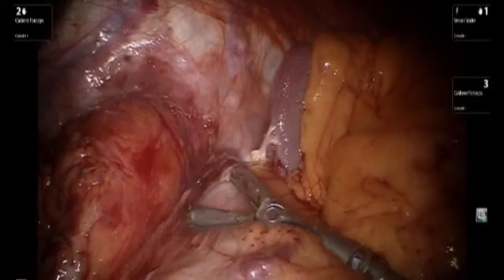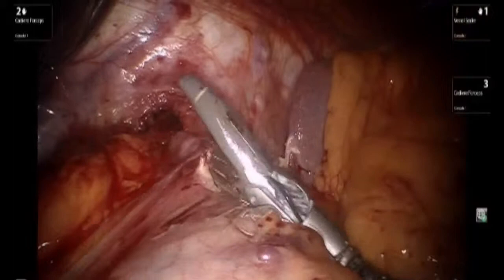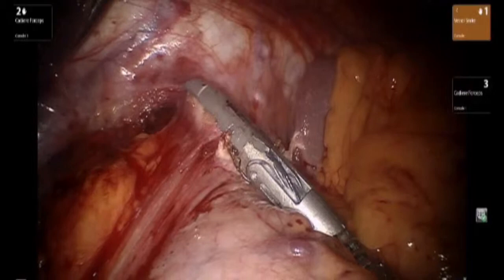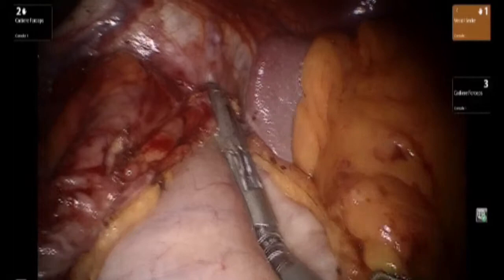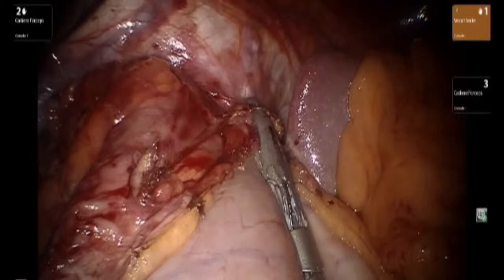At this point, we concentrate on mobilizing and bringing up the attachments to the left side. One must take great care during dissection in this region because the short gastric vessels can be attenuated.